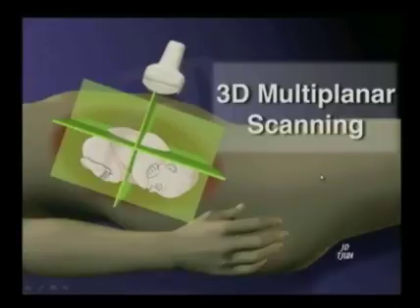A coronal plane is not possible because of a very simple reason, and this is a fundamental concept in 3D ultrasound. The coronal plane is perpendicular to the axis of the beam. No matter how I twist, I turn, rotate, angulate this probe, I can only get transverse and SAG. I can never really obtain this. It is perpendicular to the axis of the ultrasound beam.